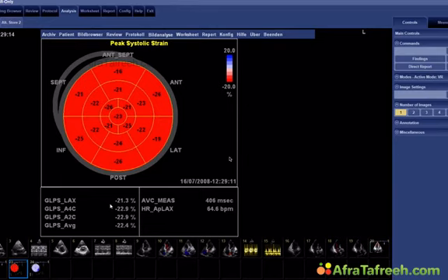I just got a question: why is it regional wall motion and not the whole left ventricle? Yes, that's a good question. Well, as a matter of fact, we do not know why the apex is more strongly involved than the other parts of the left ventricle. Maybe it is more susceptible to the high doses of catecholamines. I have, however, seen patients where not the apex, but other parts of the ventricle were affected.